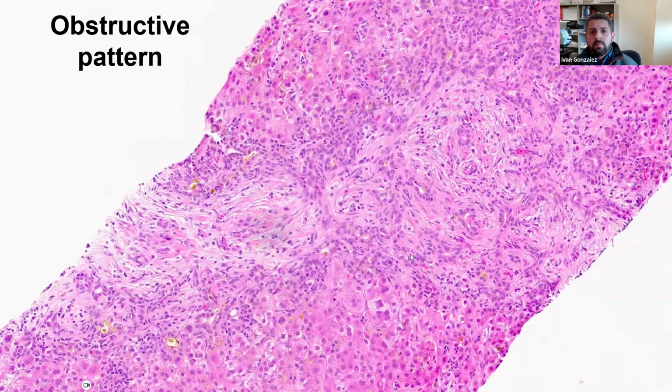So other findings of the obstructive pattern: you may or may not see a prominent cholestasis in the lobule, like here, where you have a lot of cholestasis, both hepatocellular and canalicular. You do not tend to see a very prominent giant cell hepatitis of the hepatocytes, and the main action is just happening in the portal tract with the very exuberant ductular reaction, bile plugs, the neutrophils, and the portal stromal edema.